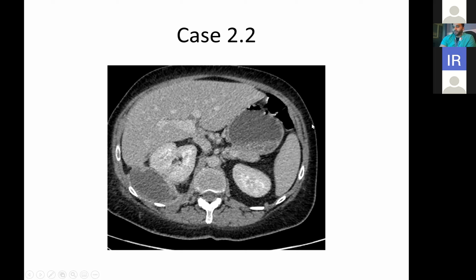And certainly appropriate positioning, if the collection is on the opposite side and if you've got a distended stomach, can be challenging because, if you were to guide your needle in into the wrong direction, you could be entering the stomach as opposed to the collection itself. So that's certainly something to be aware of and to be careful about, because it's obviously, certainly quite distressing for the patient and for the team as well involved.